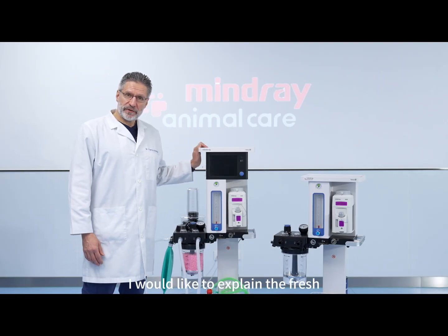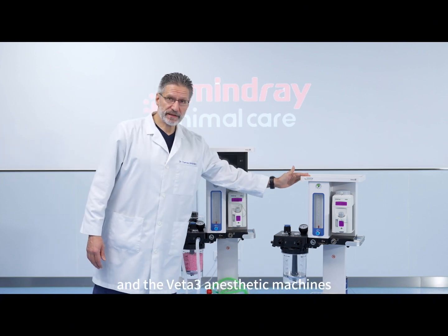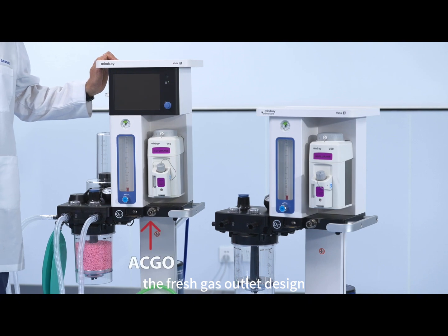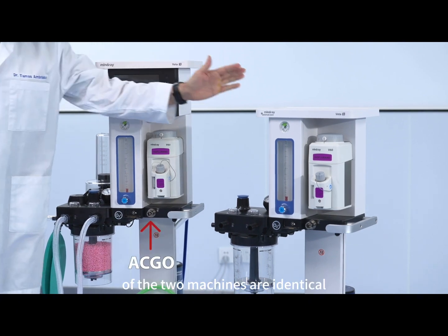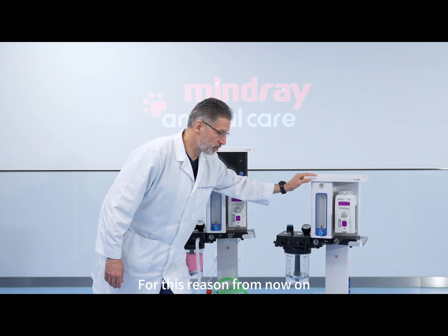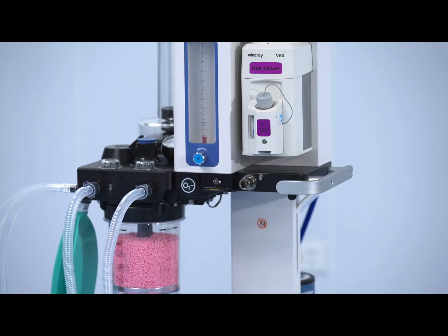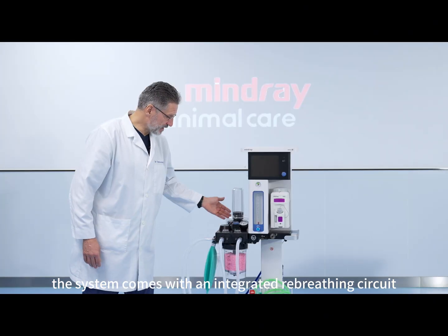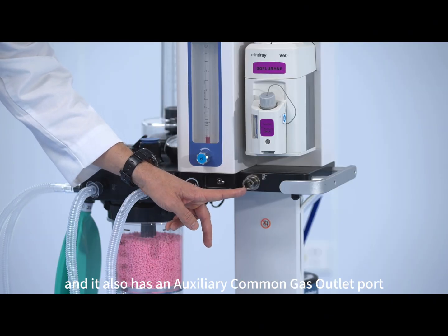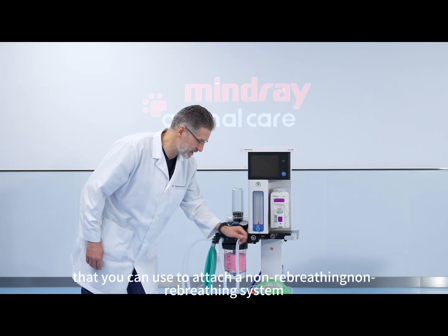In this video I would like to explain the fresh gas outlet of the VETA 5 and the VETA 3 anesthetic machines. As you can see, the fresh gas outlet design of the two machines are identical. For this reason, from now on we will focus on the VETA 5. The system comes with an integrated rebreathing circuit and it also has an auxiliary common gas outlet port that you can use to attach a non-rebreathing system.